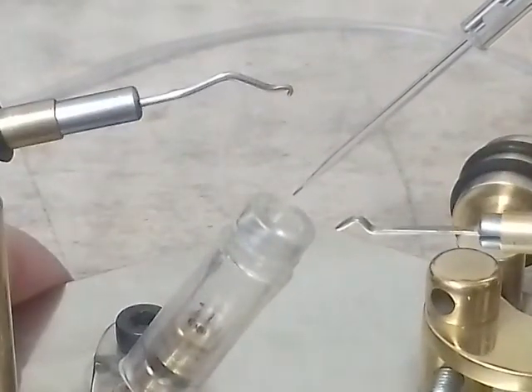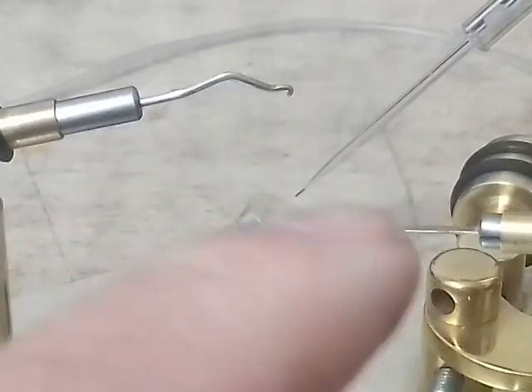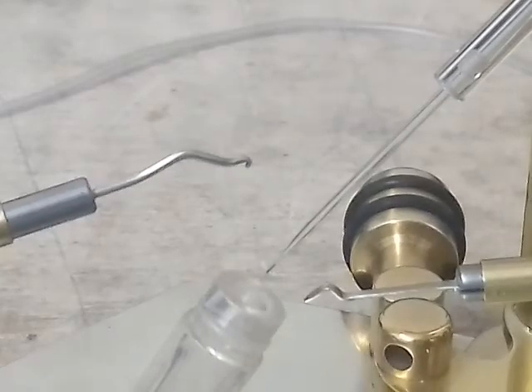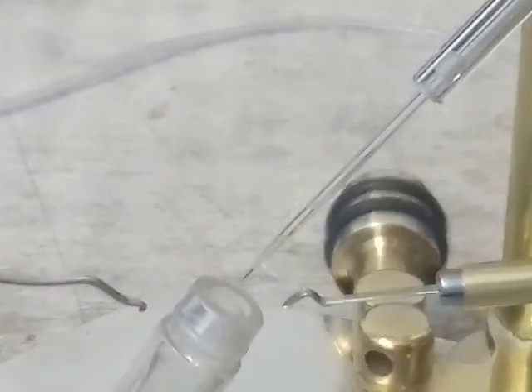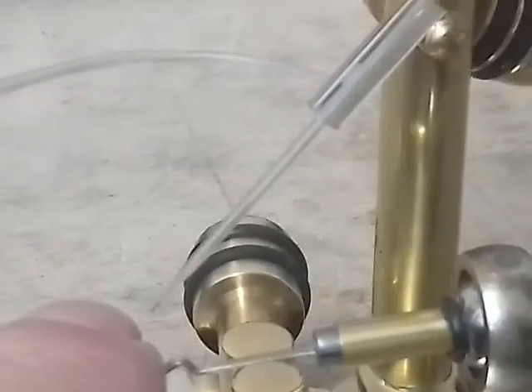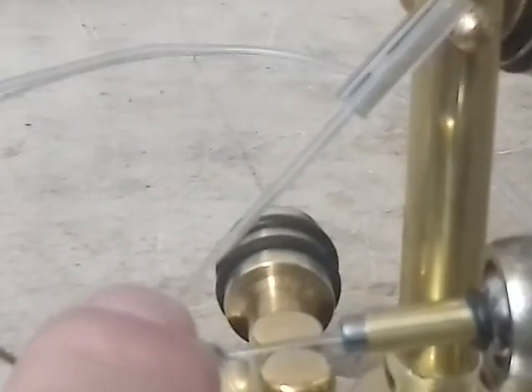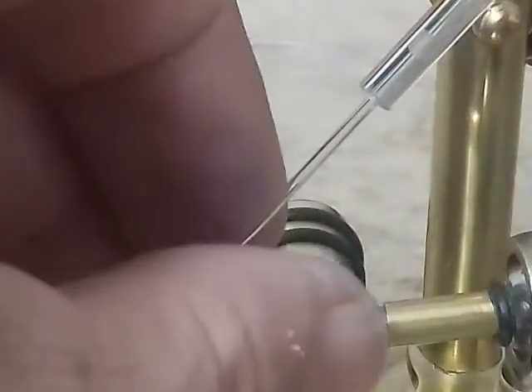That's a better picture. And literally it's not even a quarter of a turn for half a millimetre, it's probably a tenth of a turn of the knob to move it half a millimetre. And I've retained the tube within the tube, so if you did get a beginner that was a little bit heavy-handed, and they actually put too much pressure on the quill itself, I'll put my nail underneath it there. If I put too much pressure, you see how the needle floats inside there? It just floats.